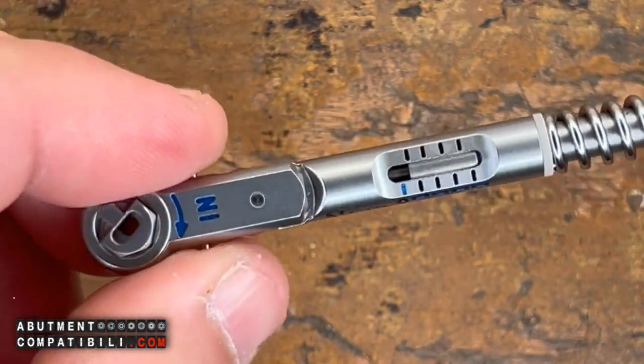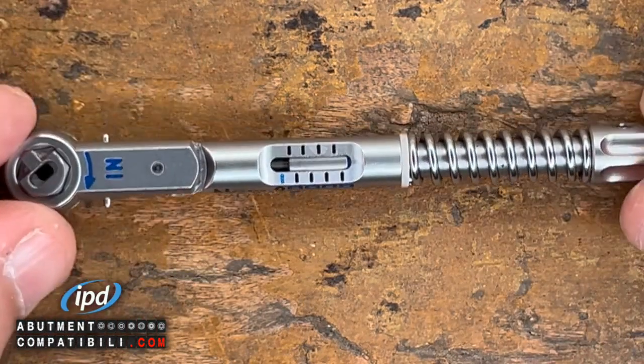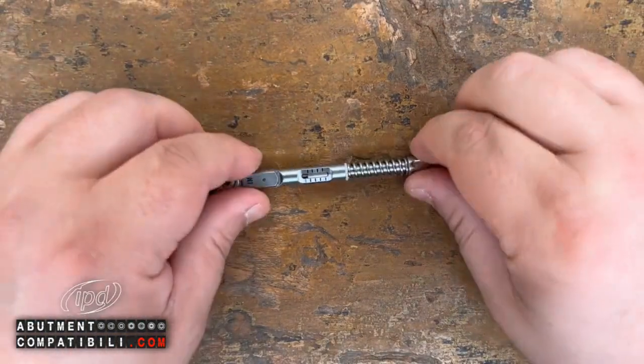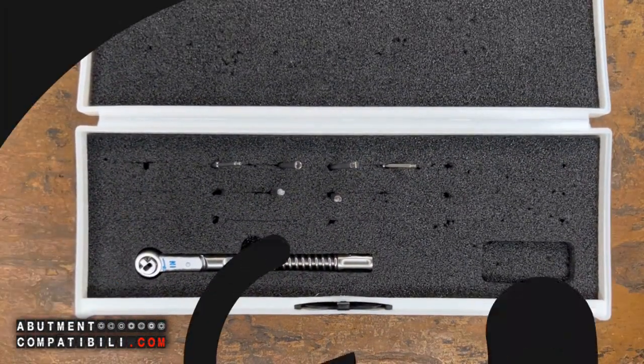Please remember to clean it. Occasionally, disassemble it completely and clean it internally as well, because it is a measuring tool. And like all measuring tools, it needs to be handled with precision. This is the kit — otherwise referred to as Ratchet 5.